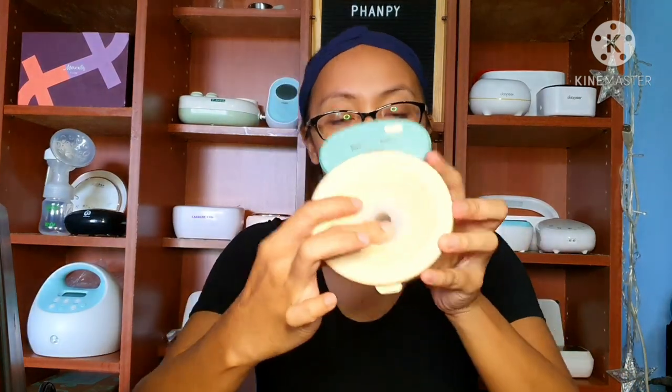It is very important na ma-measure niyo yung nipple size niyo. Kasi kapag hindi tama yung insert na gagamitin niyo, masakit siya mag-pump. So it is very important na malaman niyo yung nipple size niyo. Yung mga ganitong insert, hindi siya fit sa 20mm na flange. So kung hindi ka 20mm or 21mm na nipple size, ang gagamitin mo yung 24mm para mag-fit yung flange mo. Like this one.